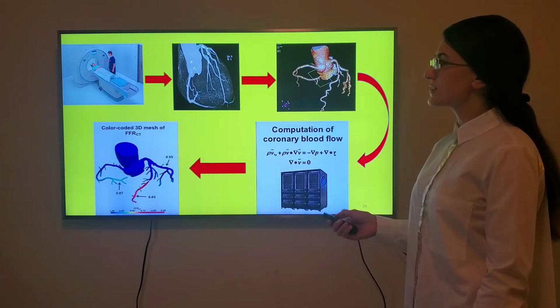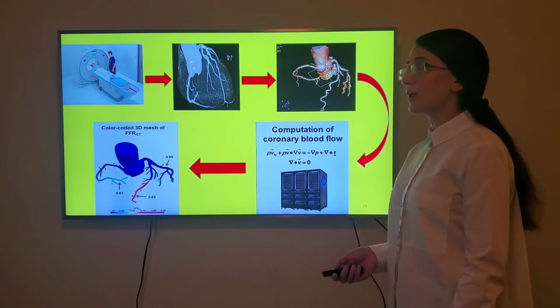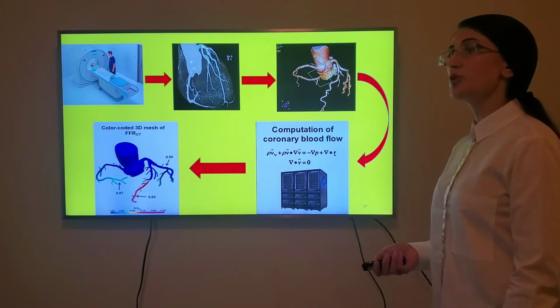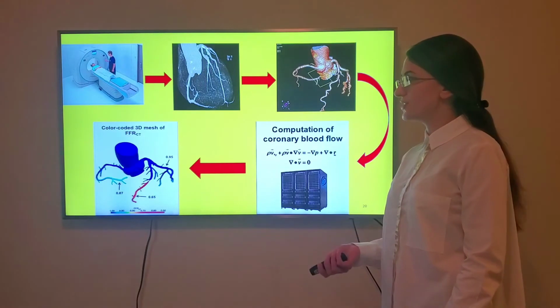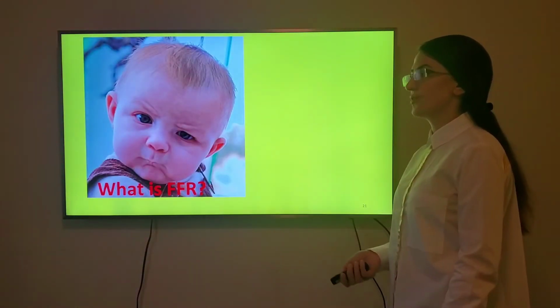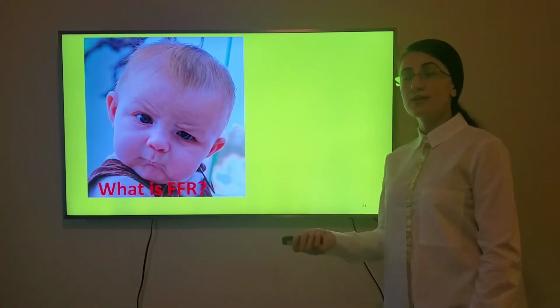All these numbers are very important. Every time when we talk about Heartflow, we mention Heartflow FFRct. So you can have a question, what is FFR? What does FFR mean?